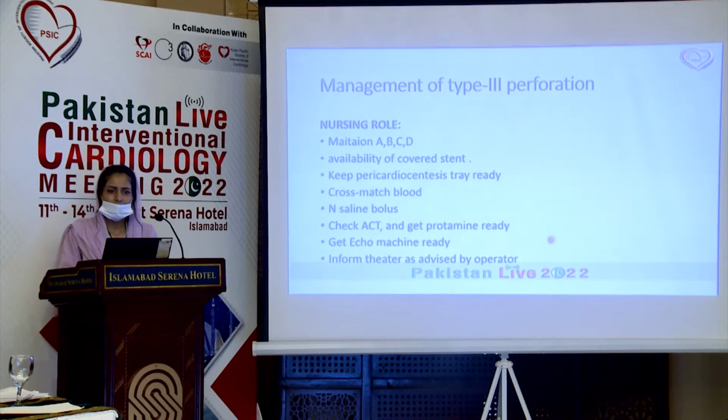At this step, this is the nursing role in the management of type 3 perforation. Maintain airway, breathing, circulation, availability of covered stent, keep the pericardiocentesis tray ready, cross-match the blood, normal saline bolus, check ACT and get protamine ready, get the echo machine ready, and inform theatre as advised by the operator.